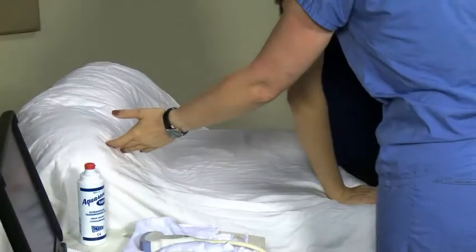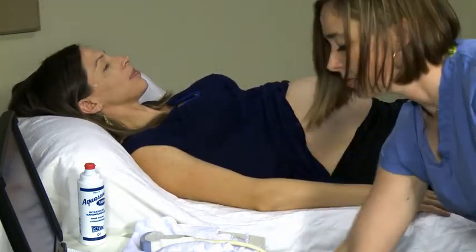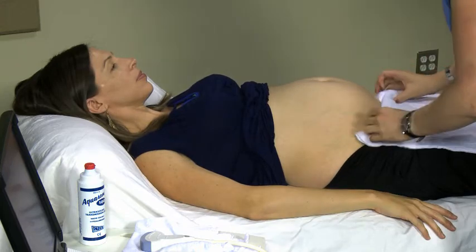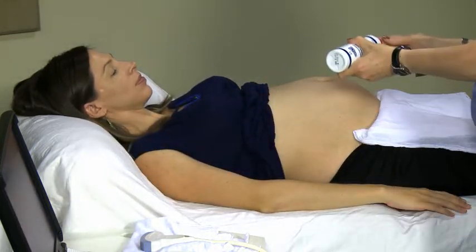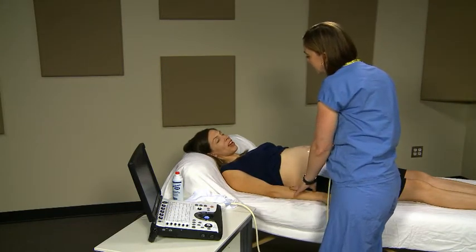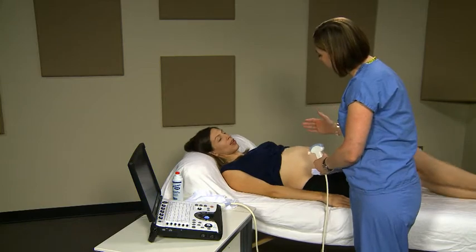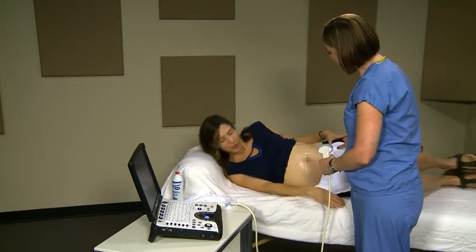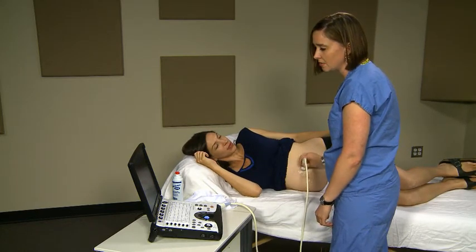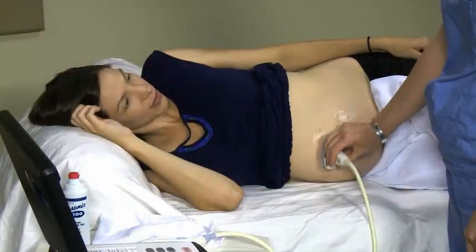You will then have the patient lie down on the bed to perform the ultrasound. Make sure to use linens or napkins to protect the patient's clothing from the gel. It is important to take care of the patient while performing the ultrasound exam. Sometimes the patient starts to feel faint from lying on her back for so long. You may notice the patient start to move around as if she is trying to get comfortable. She may not tell you she is starting to feel faint, so it is up to you to ask the patient how she feels. If she says she doesn't feel well, have her roll onto her side — this should make her feel better right away.